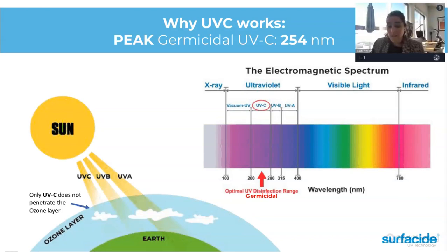Okay, good. I saw the air purifier has 3 speeds along with UV light. That's great. Honestly, that's a great way to do it: it's bringing the air in right over the light. That's exactly what you would want to see. Essentially that's what our ceiling ones do as well. So I think that's a really good solution that you found.